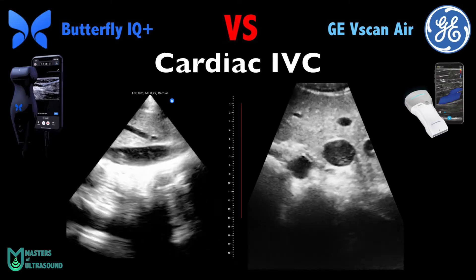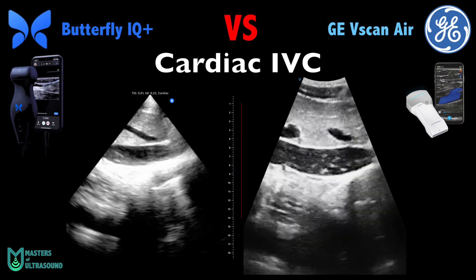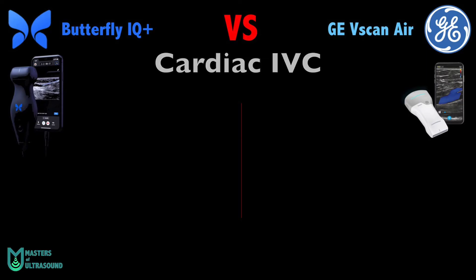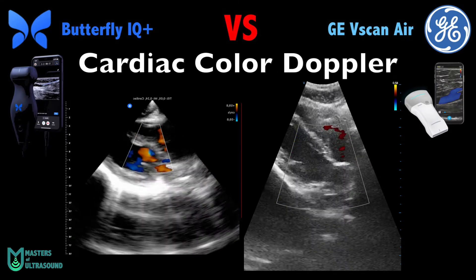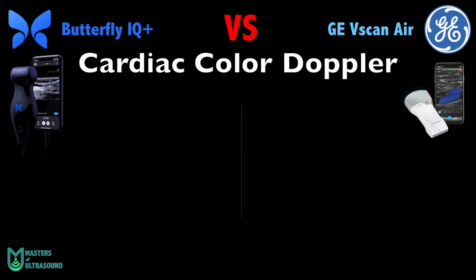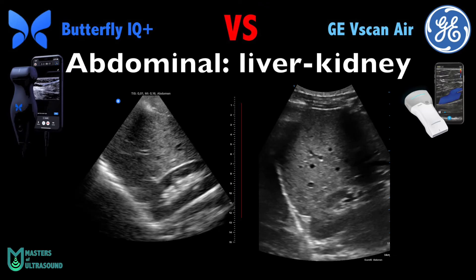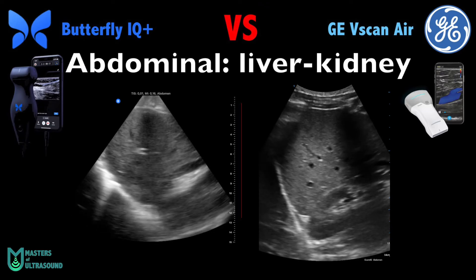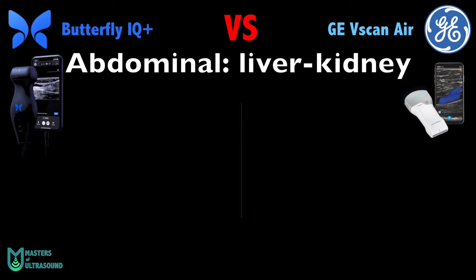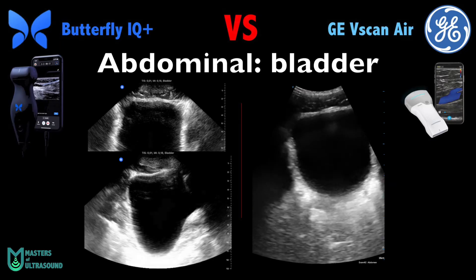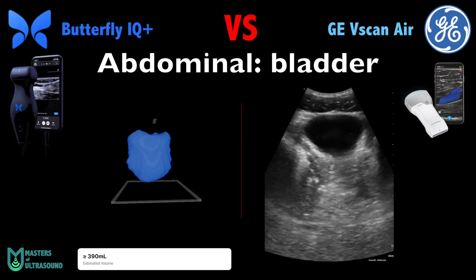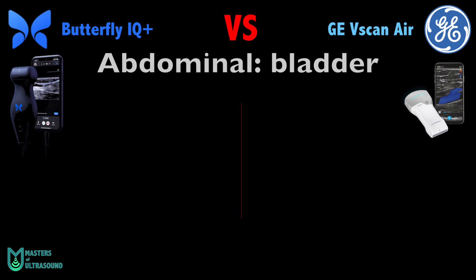Here you can see the inferior vena cava — the definition of the Vscan is higher again. Now this is a weak point for the Vscan: cardiac Doppler, where the Butterfly IQ is superior. The liver-kidney interface — Morrison's pouch — is pretty similar between the two, maybe slightly better on the Vscan. The Butterfly IQ has a tool to calculate bladder volume with true-axis measurement, whereas the Vscan has only B-mode.